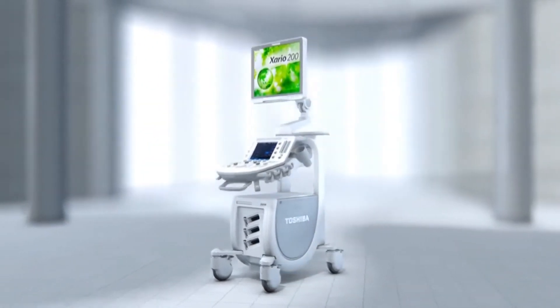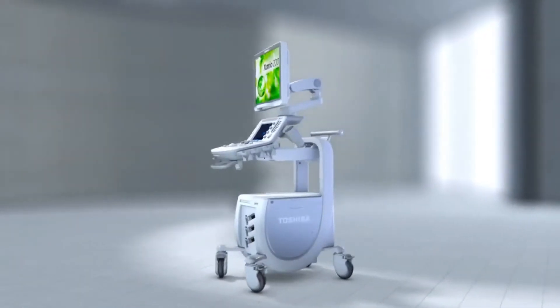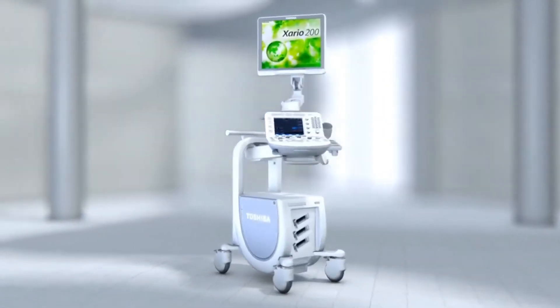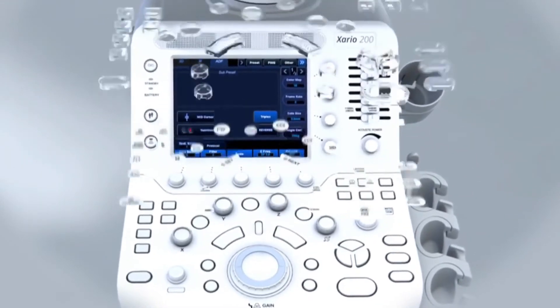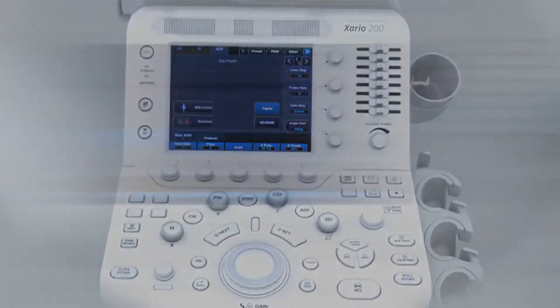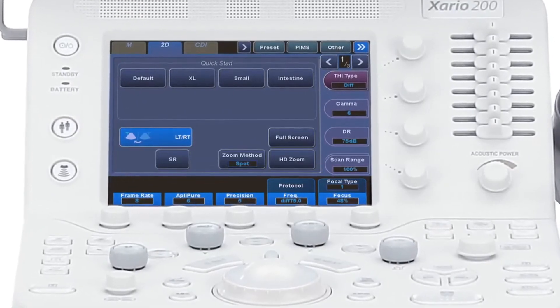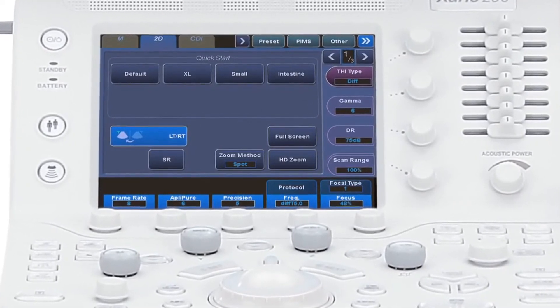The Exario 200 is a sleek, mobile ultrasound system designed to fit into the smallest of rooms, offices, and clinics. Incorporating Toshiba's unique iStyle productivity suite, the Exario 200 includes a customizable user interface and quick-start presets to suit your personal preferences and enhance productivity.